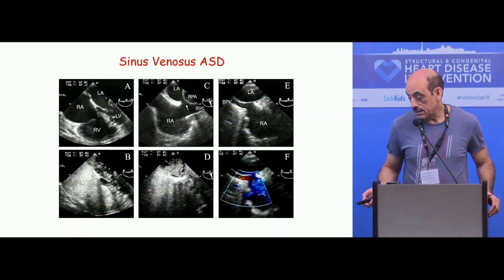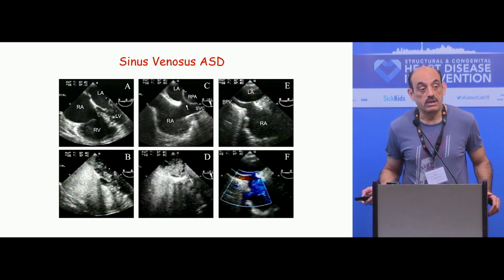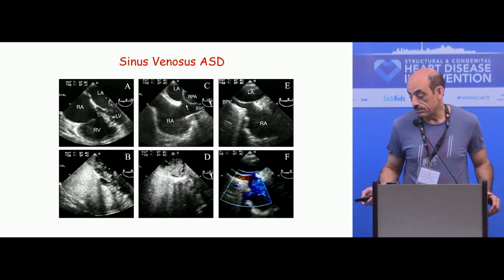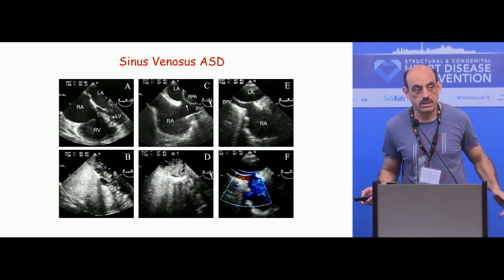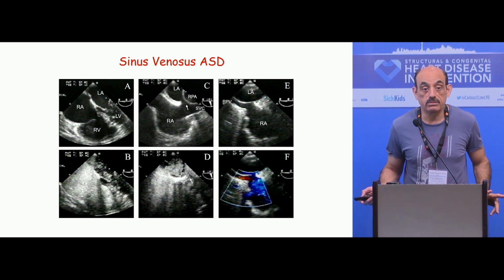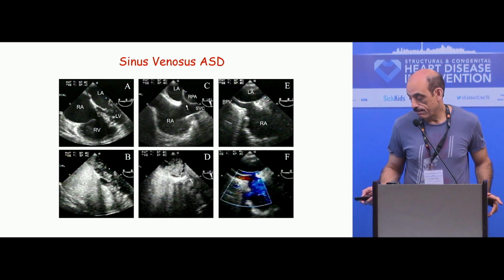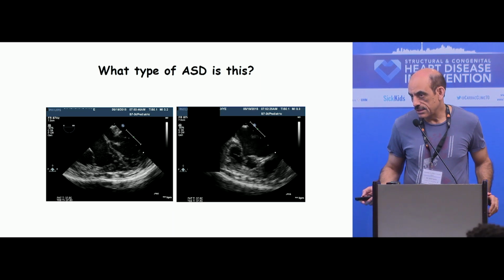And if you see in these still pictures, in four-chamber view, you don't see an atrial septal defect, but when you go to the bicaval view, you definitely see a very large atrial septal defect, and the structure above it, always initially, if you're not paying attention, you will think it's some, what is that? That is always right pulmonary artery. Okay, so what type of ASD is this?